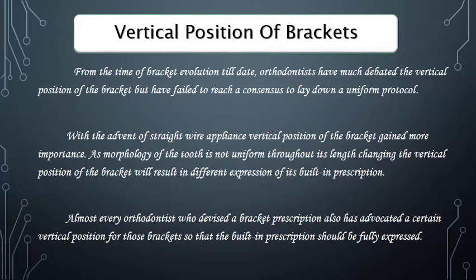Changing the vertical position of the brackets will result in different expression of its built-in prescription. Almost every orthodontist who devised a bracket prescription also has advocated a certain vertical position for those brackets so that the built-in prescription should be fully expressed.